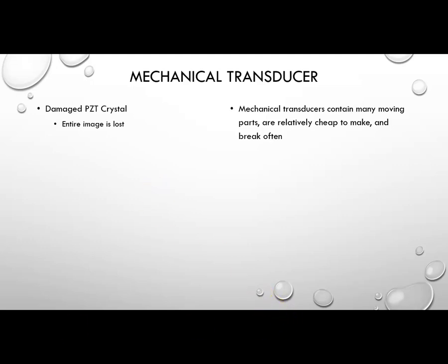Having said that, as you know, I've got the machine and the storage there that we use, and it's from 1982 and still works. So sometimes, I guess, if you take care of them, they can still work very well. So I've got one mechanical transducer that does work and one that is broken, but it's interesting that it still works.